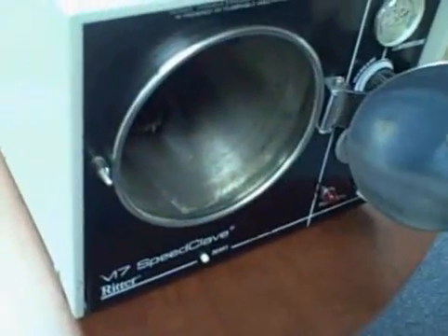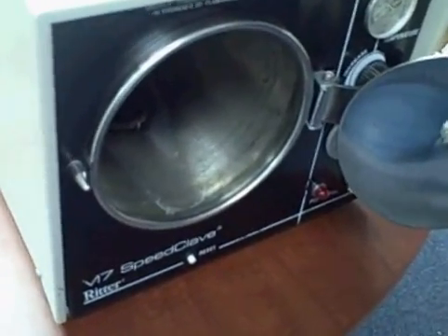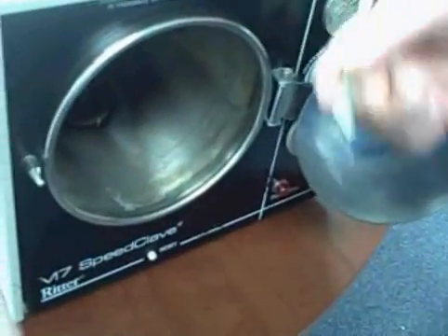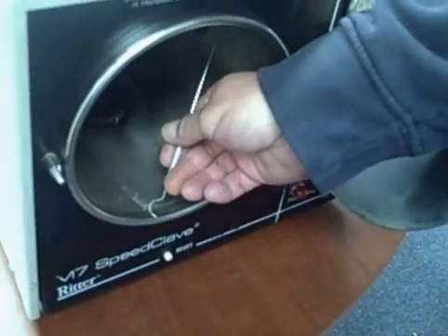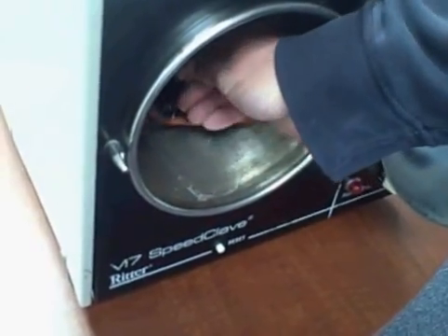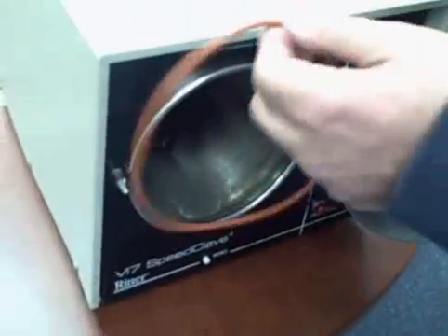In order to change the gasket, you can use a bobby pin or a sharp instrument. What you want to do is get behind the lip and pull the gasket out of the groove, just like that. That was simple. Right. Replace the new one.